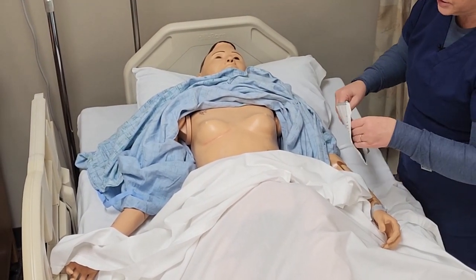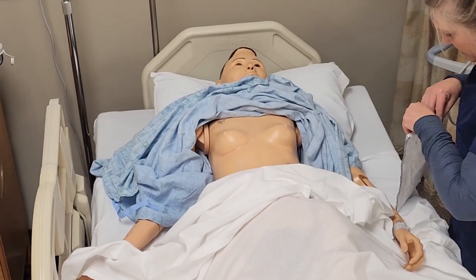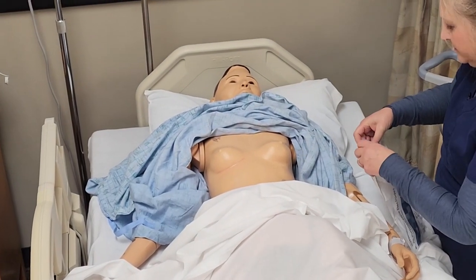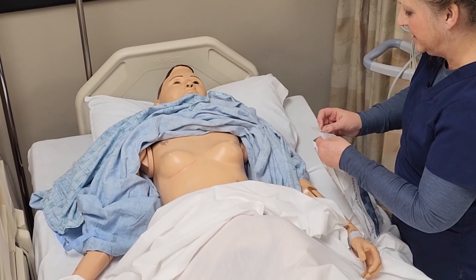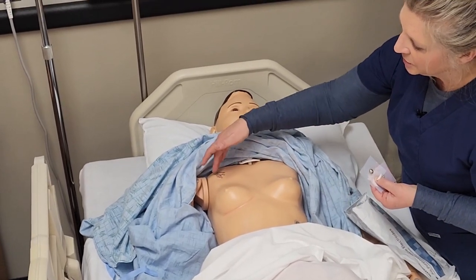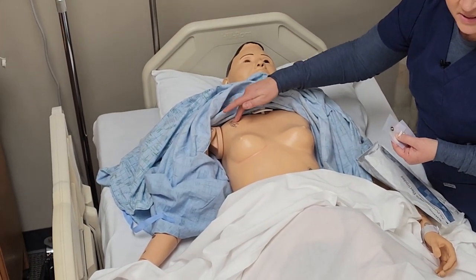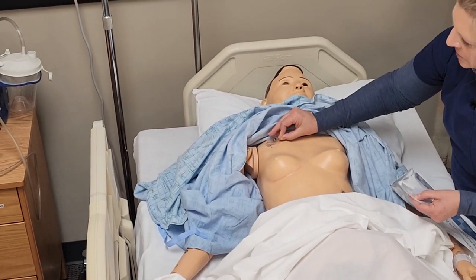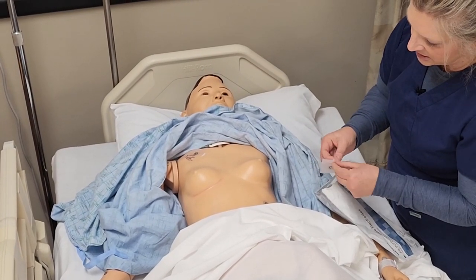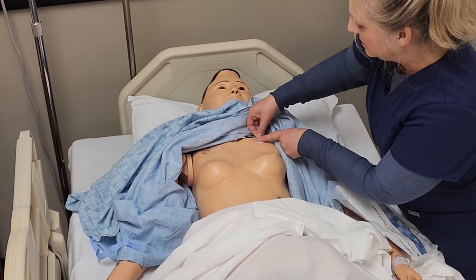We have our electrodes here and we're going to be using five leads with this patient. Our first lead — we're going to have one on the right and the left upper extremity. You want to place it somewhere between the humeral joint up in here. Try to avoid placing them right on the bone. Then we have the left upper arm or chest wall area here.